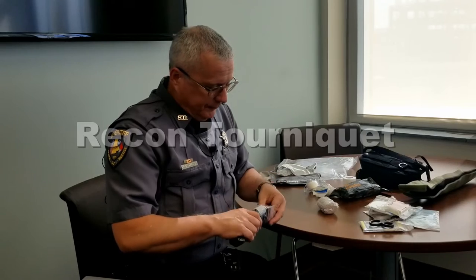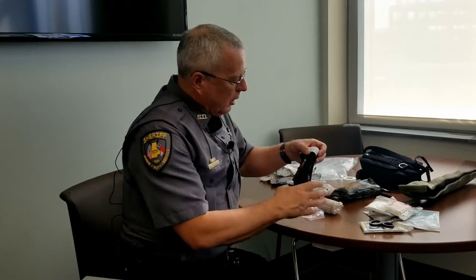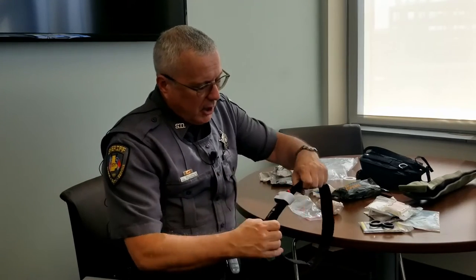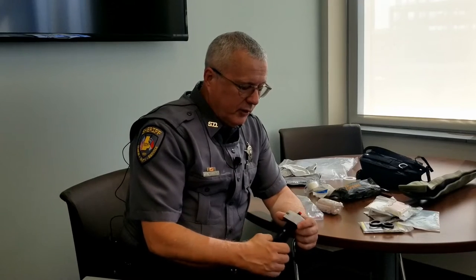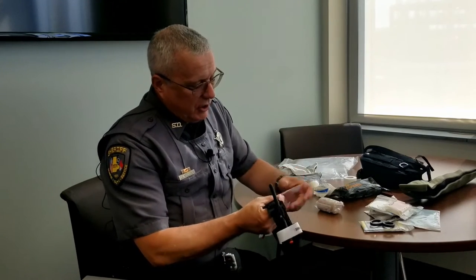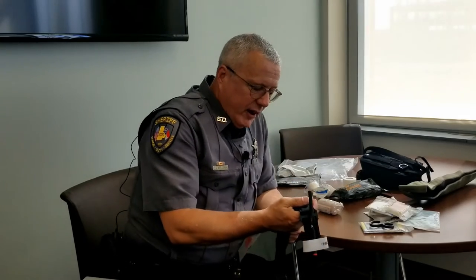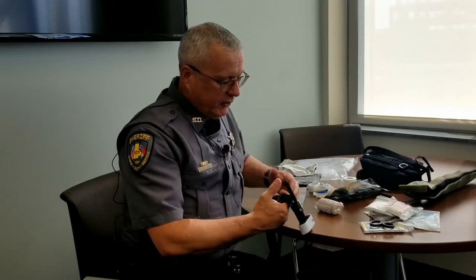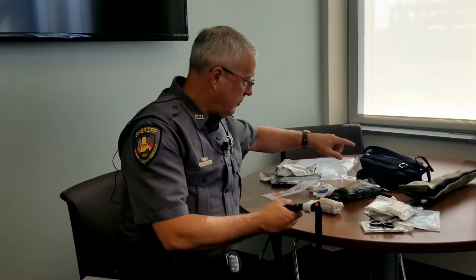This is the Recon tourniquet and everybody should have gone through tourniquet training. This is basically the same as any other tourniquet — Velcro with a windlass to tighten it. When you get this kit, it's going to be shrink wrapped in plastic. Open the plastic, familiarize yourself with the tourniquet, and make sure you know how it works and what all the components are. These tourniquets have a tendency to break down with heat and UV light. We can't do anything about the heat in the patrol car, but we can protect it from UV light with the Ziploc baggies. Once you get it set up the way you like, put it back in the bag and then back in the pouch.